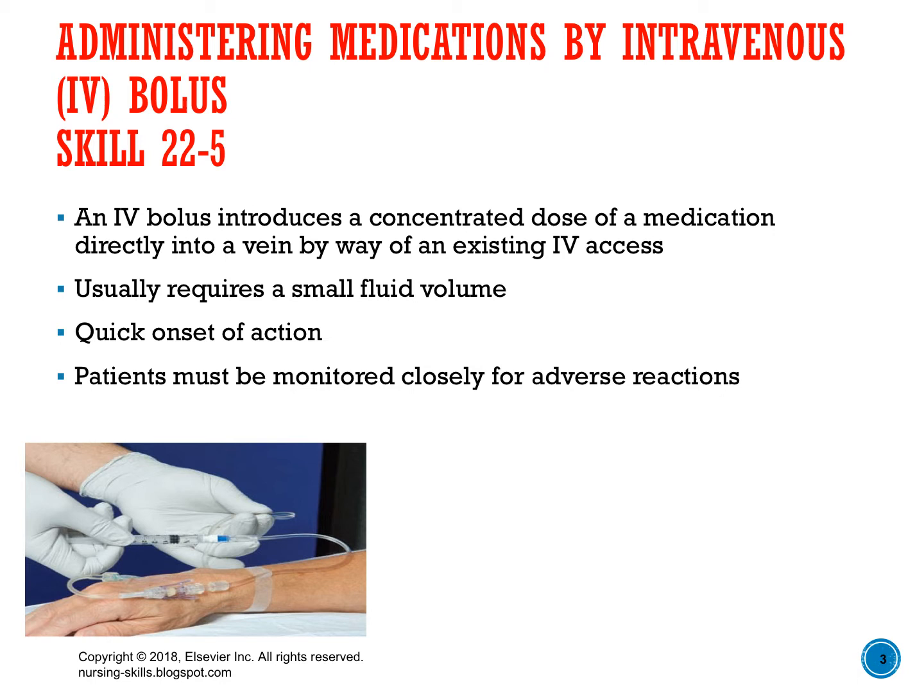IV bolus medications can cause direct irritation to the lining of the vessels because they are so concentrated. You always want to make sure that before you administer a medication through an IV, you check to make sure that the IV is actually in the vessel and it hasn't infiltrated or moved out of the vessel into the tissues, because sometimes certain medications can be very irritating or even caustic to the surrounding tissues.